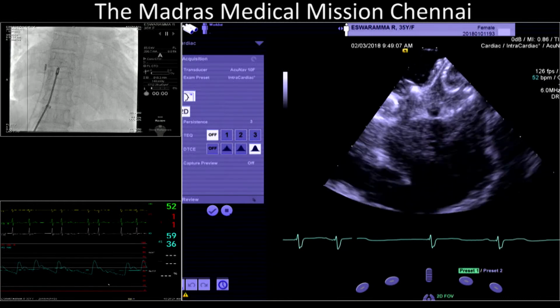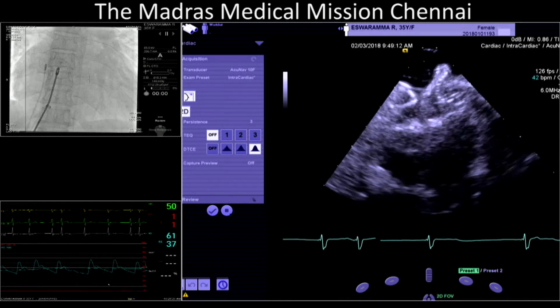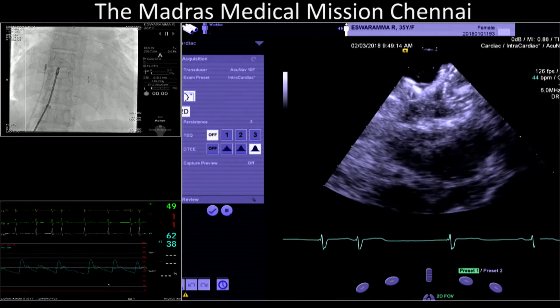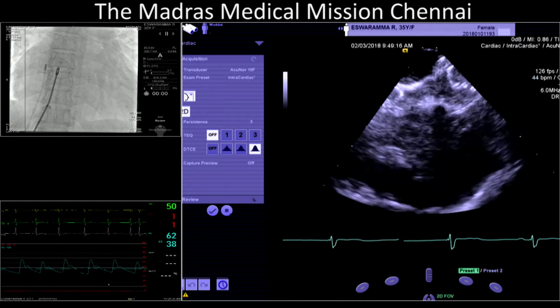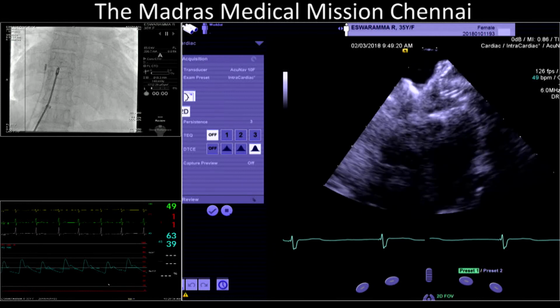Shiva, is that blue pressure the aortic pressure or the pulmonary artery pressure? The blue is the aortic pressure. What has happened is I gave amiodarone and metoprolol, so she continues to be in a junctional rhythm. Make the hemodynamics bigger.